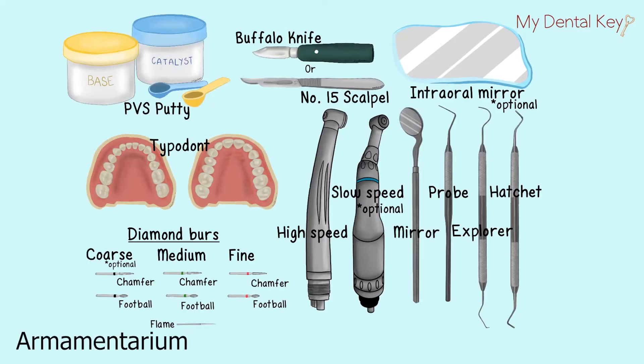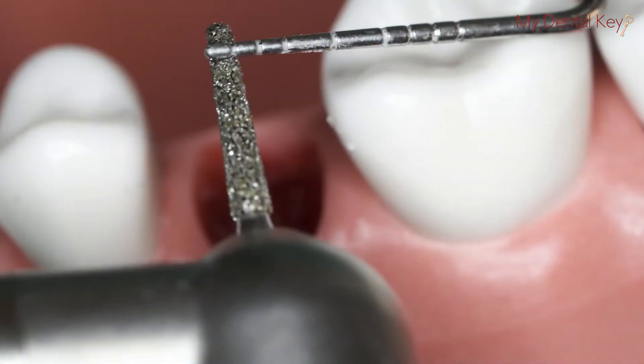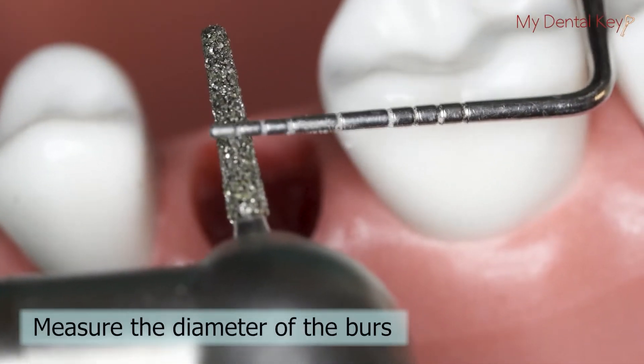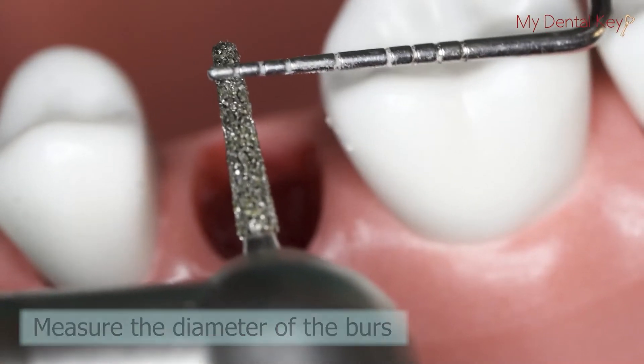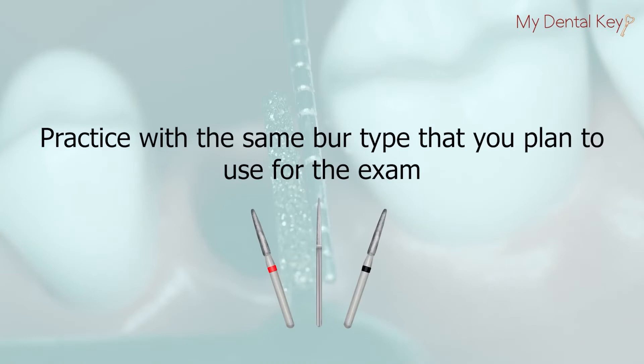Assemble the armamentarium as shown on the screen. It's helpful to measure the diameter of your burrs in order to use them for depth grooves in subsequent steps. Practice with the same burr type that you intend to use for the exam. Even if you get a new burr for the exam, this will allow the procedure to be as repeatable as possible and therefore cut down the chances of error.